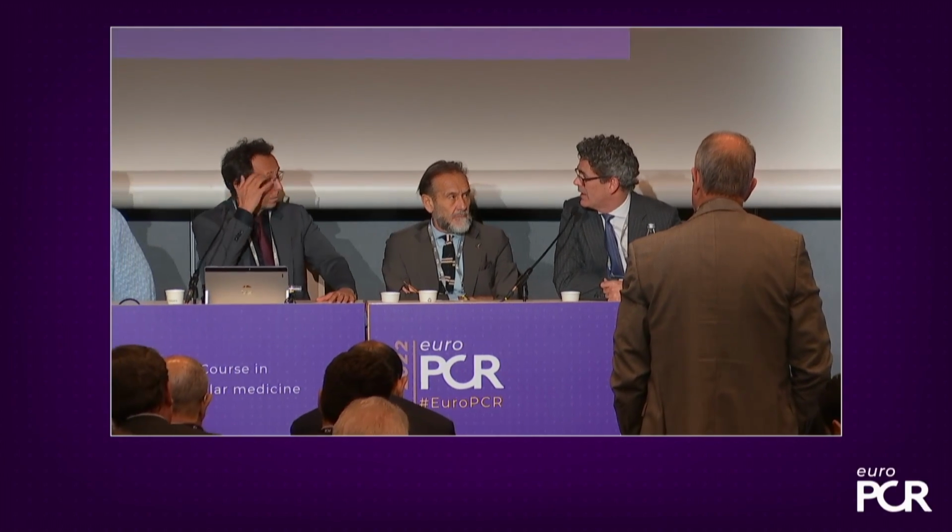Yeah, I mean, I think we've been a little surprised at how efficacious it is in this setting. I think we were surprised to see the data from the Disrupt CAD 1 to 4 series of studies where actually you got good stent expansion irrespective of the calcium distribution. Yes, you may see the macrofractures in the concentric calcium, but in fact we know that the mechanism of modification when you've got eccentric is not just macrofractures, but a lot of these microfractures.